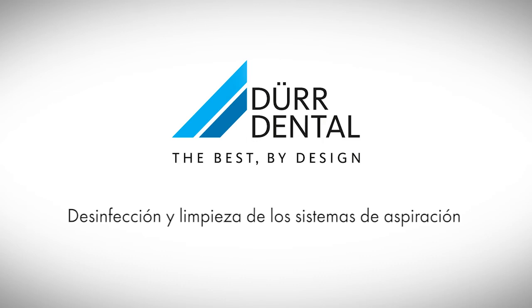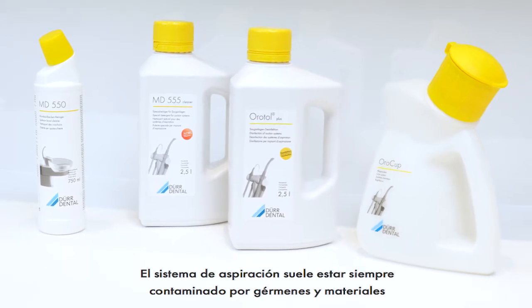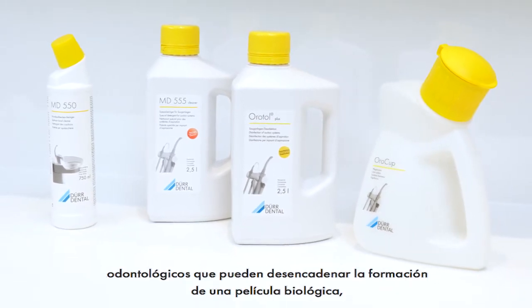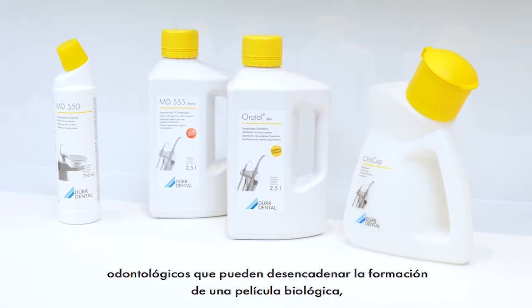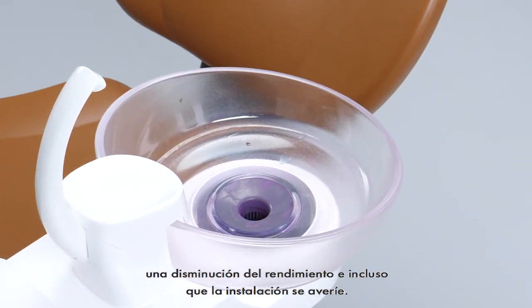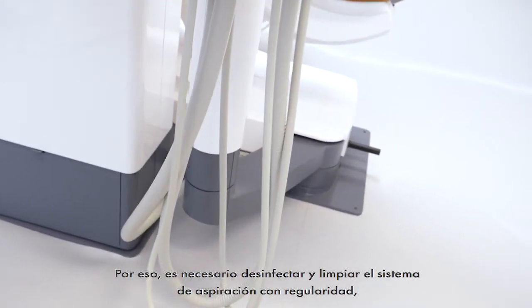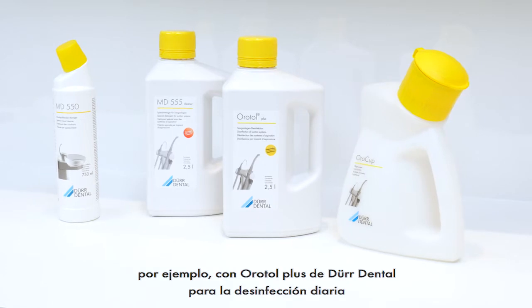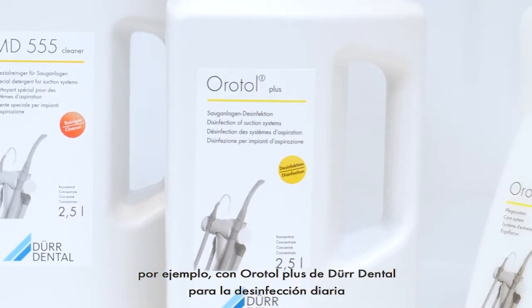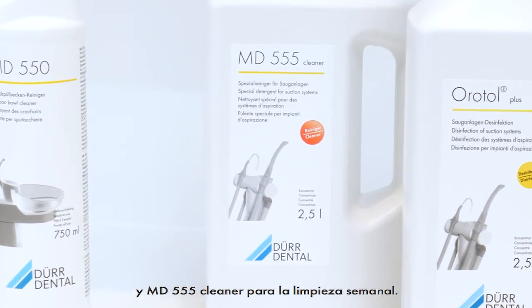Disinfection and cleaning of suction systems. The suction system is contaminated to a considerable degree with germs and dental materials, which could lead to the formation of biofilm and a drop in performance or even to the failure of the unit. Therefore, it is necessary to clean and disinfect the suction unit regularly, for example with Oratol Plus from Der Dental for the daily disinfection and MD-555 cleaner for the weekly cleaning.